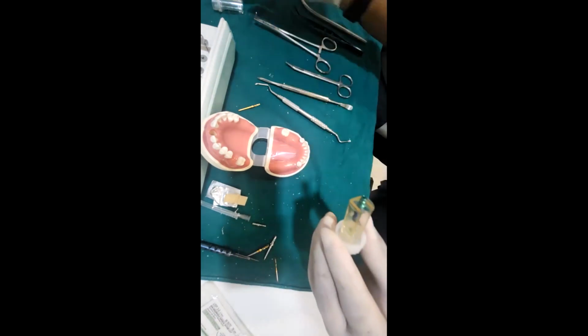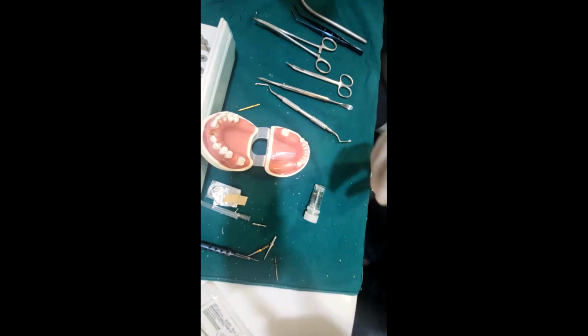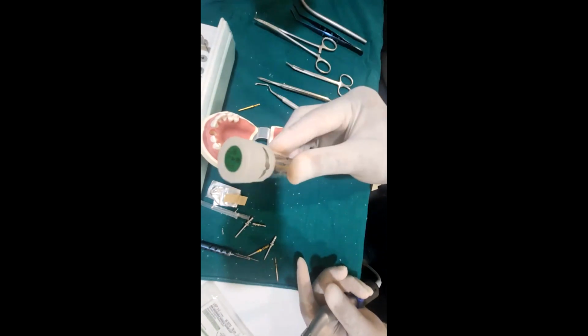You are supposed to keep everything ready before you open this, and your associate is supposed to remove the implant from the box and only drop this in your hand.